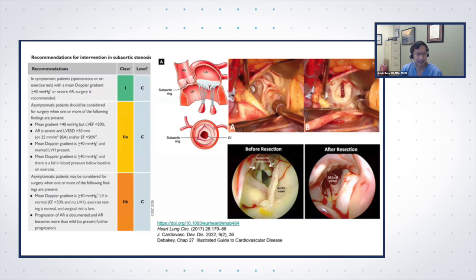In which case, are we really going to be MRIing or TEing every aortic stenosis? I think, clearly in this case, you had an echocardiogram whose leaflets of the aortic valve were not consistent with the severe AS suspected, and so that led them to look further.